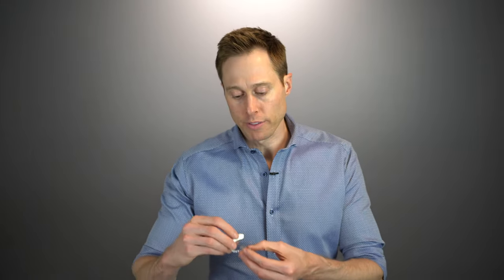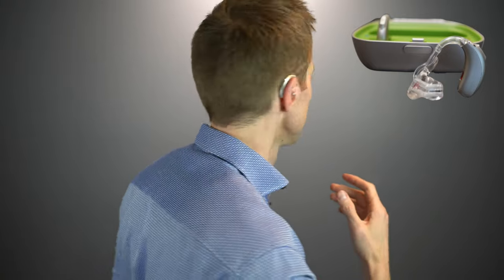Phonak recently released their new Naida Lumity behind the ear power rechargeable hearing aid, as well as their ultra power hearing aid that uses a 675 battery. Let me go ahead and show you what both of these look like as I wear them. I'm first going to put on the Naida Lumity PR hearing aid, which is the smaller of the two. It does have a rechargeable battery inside of it.